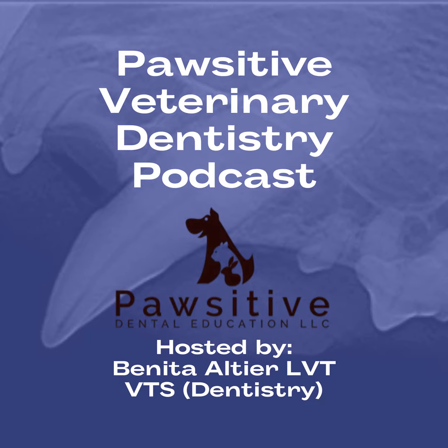And then again, take a different view. Maybe you elongate the image. Maybe you foreshorten the image. Maybe, as opposed to going straight on as a parallel, you shoot it from front to back or back to front and see if whatever area you're suspicious of goes along with the tooth root or moves away from it. And if it moves away from it, it is potentially something that may be anatomy and not something you need to be concerned with.